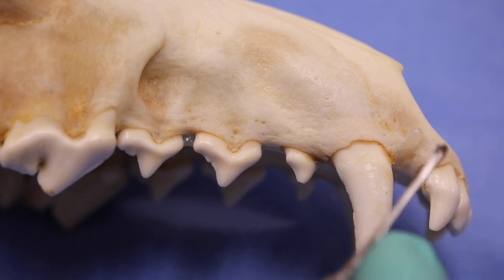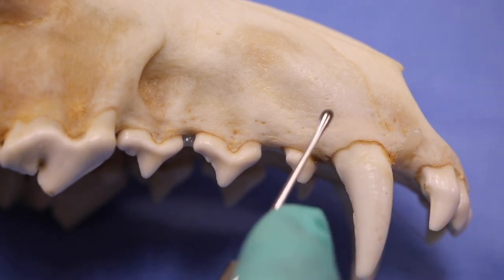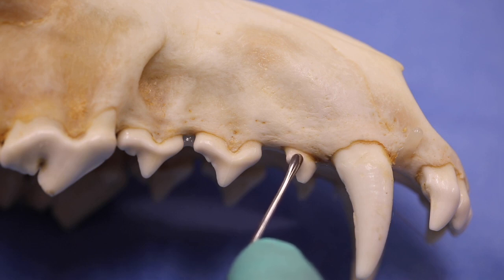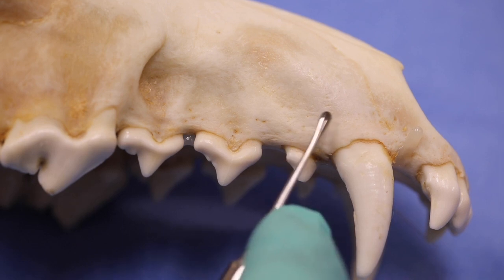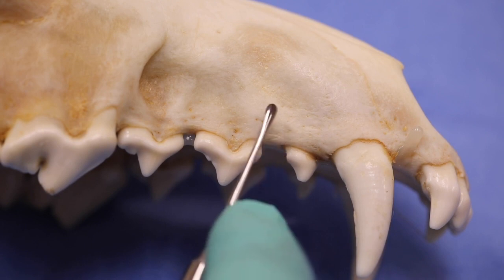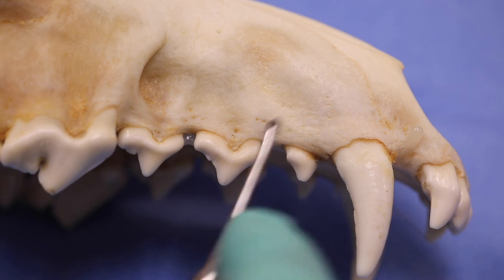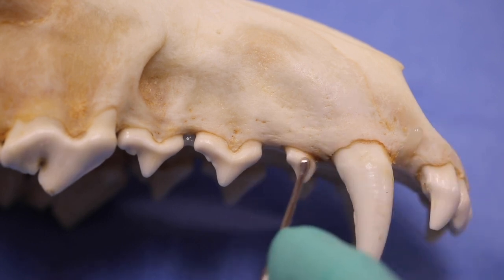So in using this, the tendency is to push this way with the elevator, so we place it underneath the marginal gingiva, and then we want to force it up toward the apical area. That's absolutely not the way that we want to do this. Number one, we don't want it to be parallel to the tooth. Number two, we want it to be at a little angulation, usually about a 15-degree angle.